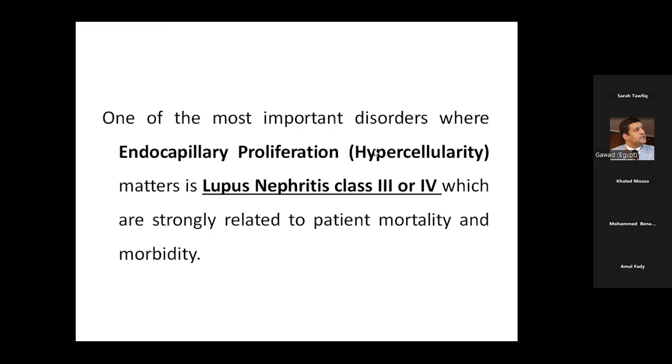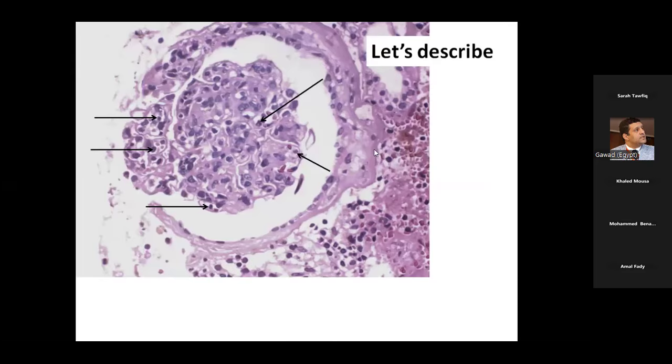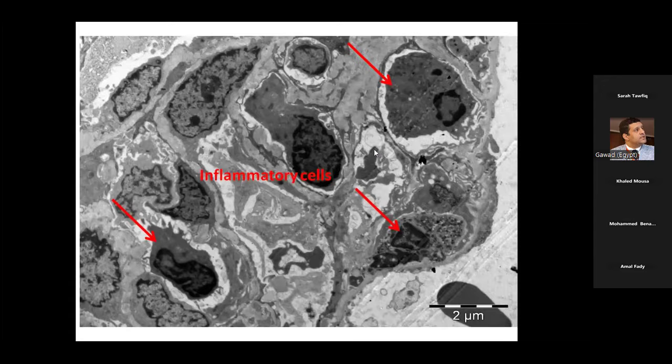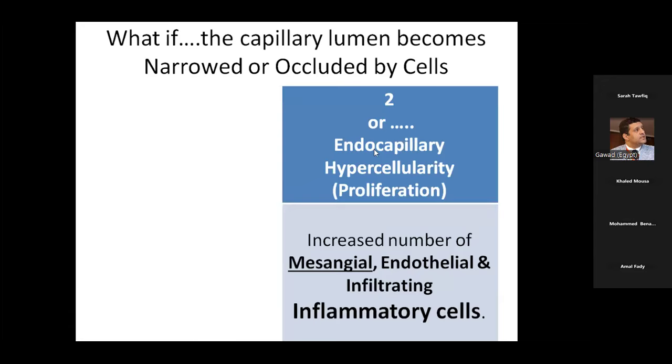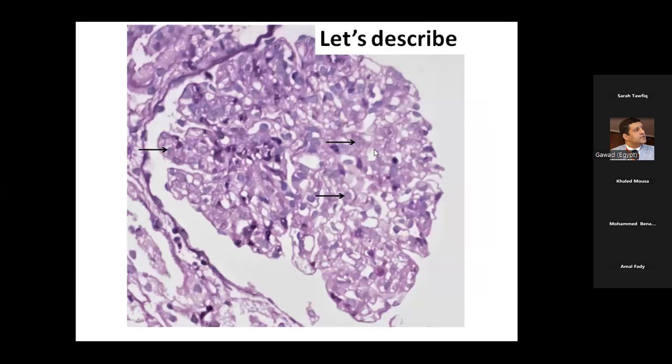Sarah, excuse me. Can you go back rapidly to the image where the endothelial cells were large and had a light color? This picture? No, no, the light microscopy. Yes, light. I'm sorry. This one? Back again. You said that here there is an endothelial injury, right?